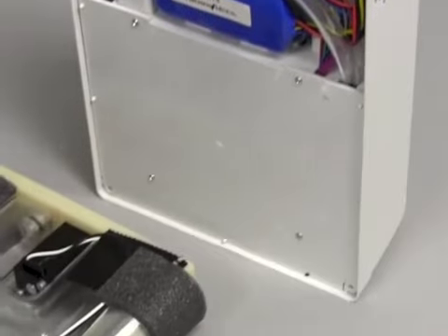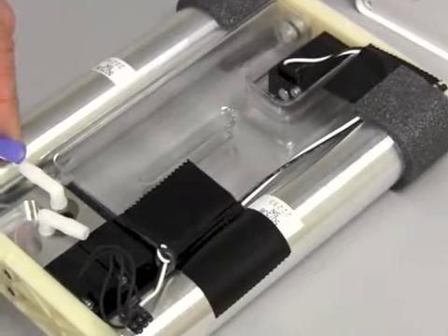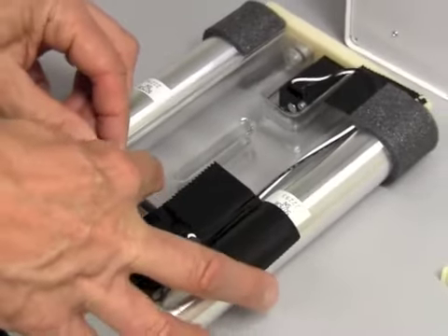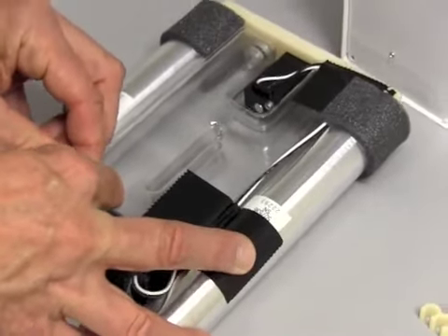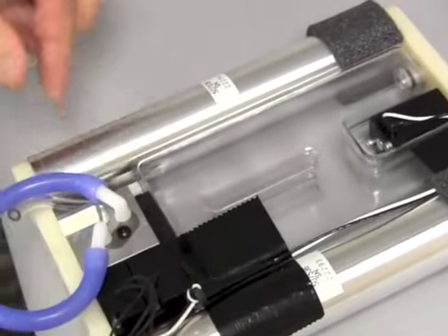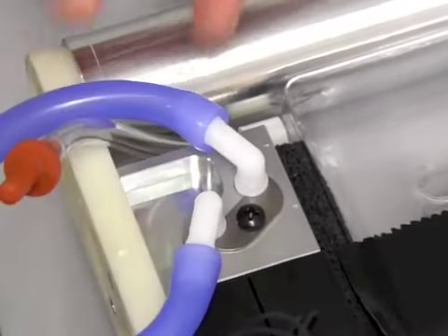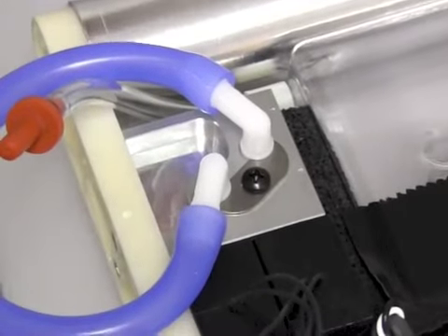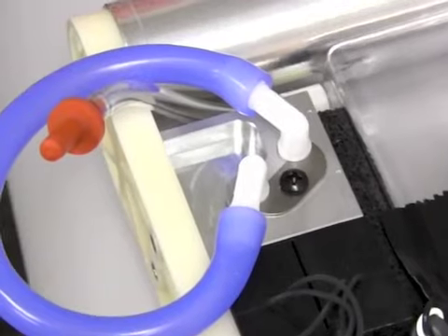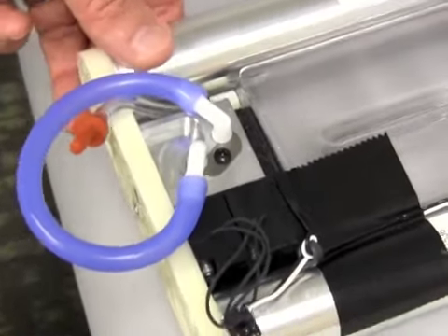When the sieve beds are removed, it is a good practice to put tubing on the 2 ports, right, and a rubber plug in the outlet for the oxygen. And what this does is stop any moisture from being drawn into the sieve beds when they're being held and waiting to be reassembled.